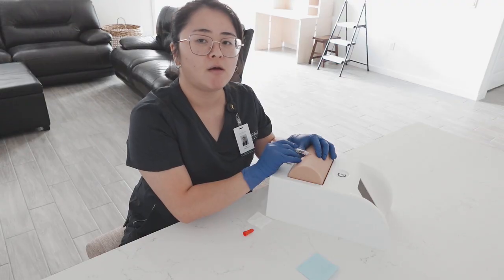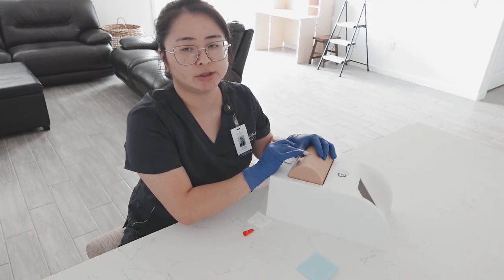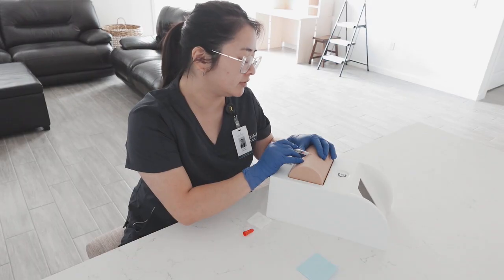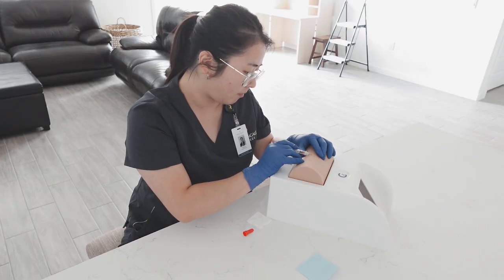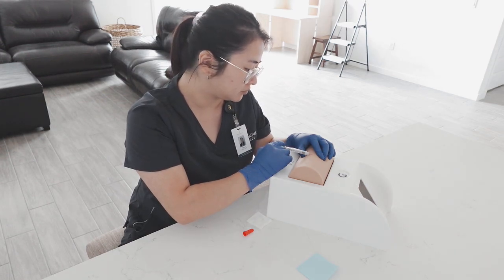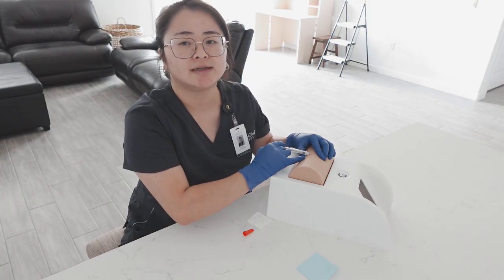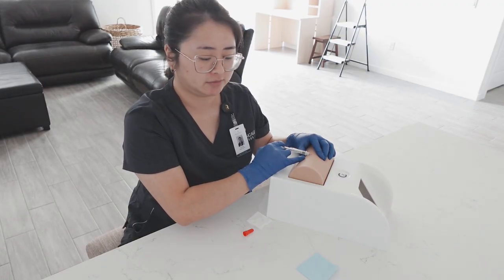and we want to make sure that we have resistance. We're going to advance through the epidermis 3 millimeters, and we want to meet resistance. I do feel resistance, and we're going to inject. Nice. Inject slowly. Okay. We should see a bleb. I do see a bleb. We should see a bleb that is 6 to 10 millimeters. It should resemble a mosquito bite.